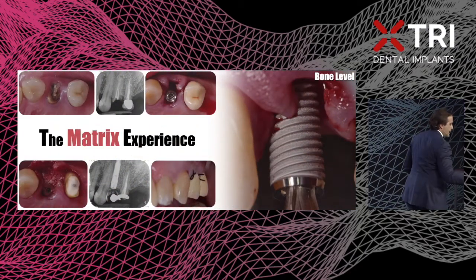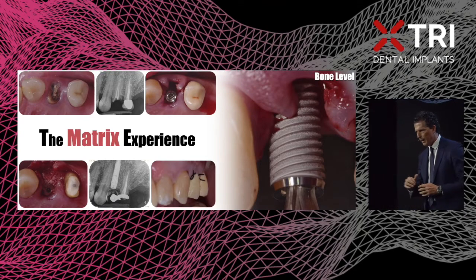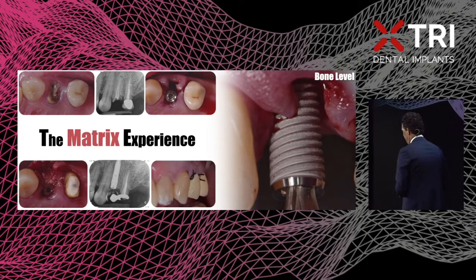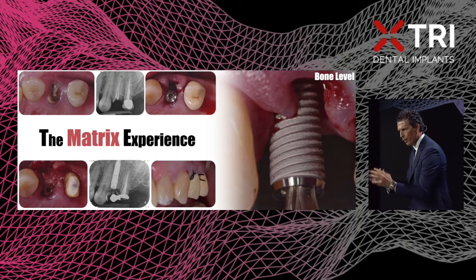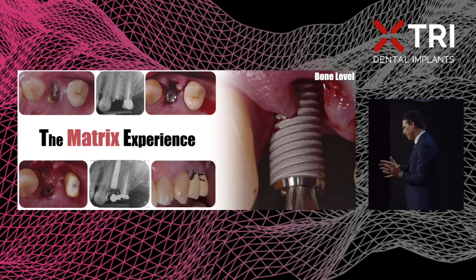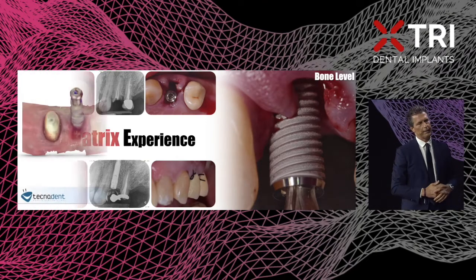That's our second case. Once again, a bone level implant in a different site. It is a first bicuspid in a patient with a high biomechanical risk profile, but low periodontitis risk profile. In the first bicuspid position, I put the bone level implant. I try to increase the volume in the vestibular side, respect the position of the implant, respect the buccal plate, and manage the provisional restoration utilizing the second bicuspid. So no immediate loading in this case.